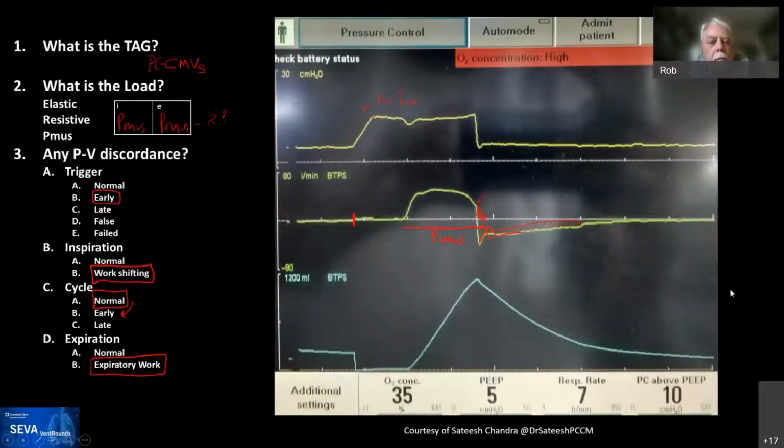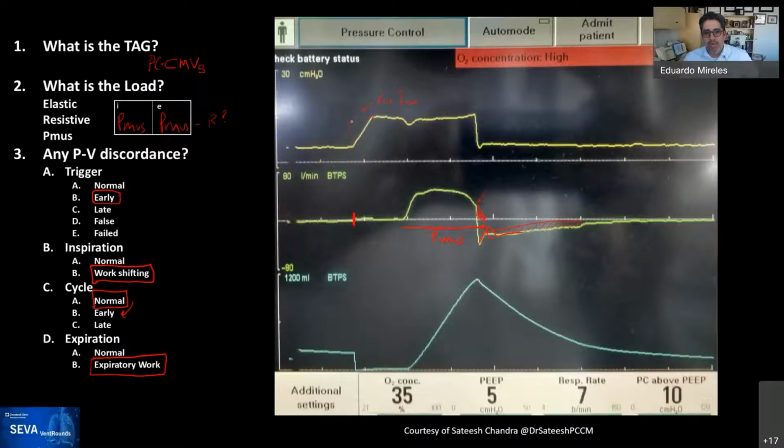A good one. Interesting. I would just highlight here the rise time. I still have no good reason why we would put the rise time lower than in a mandatory breath. I'm having challenges figuring out why we would change the rise time. Any good idea there, Rob, or anybody else? I've never seen a good reason to do that, particularly for a mandatory breath like that. The rise time should be as low as possible.